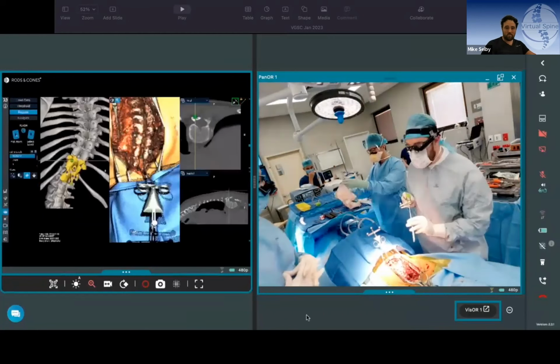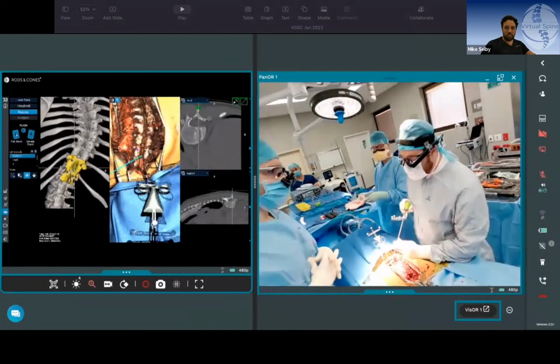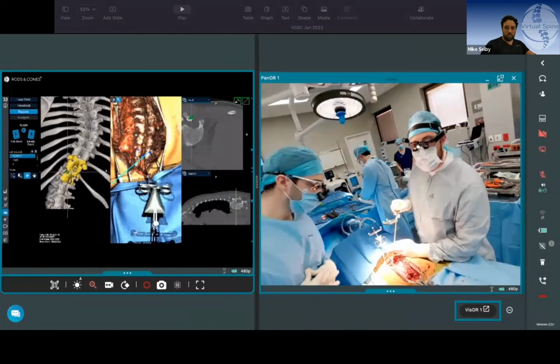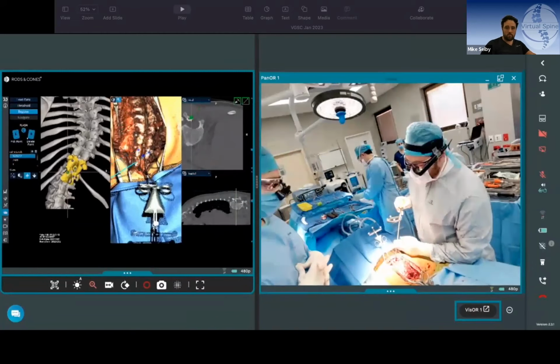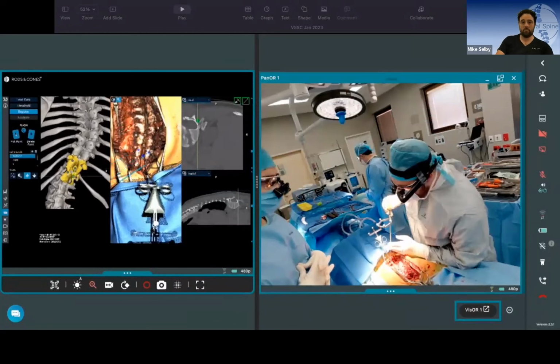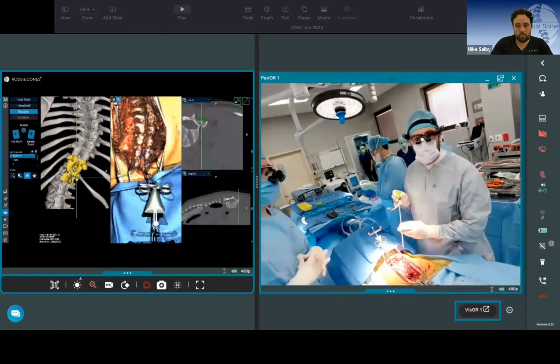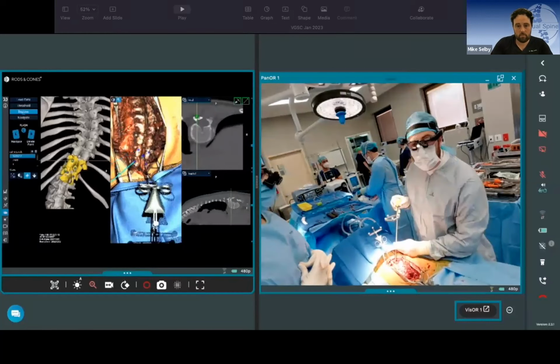Okay, number 1 point. Going to be there. Number 2 point on the SP. Number 3, laminar. We'll just move it a little bit. Just there. Yep, that's the one. Coming in with 4. 5 is on the left, on the other side. Move 6 to the mammillary process on the other side. So drag it all the way over to that, because we'll see that better. It's the high side. Yep, done.